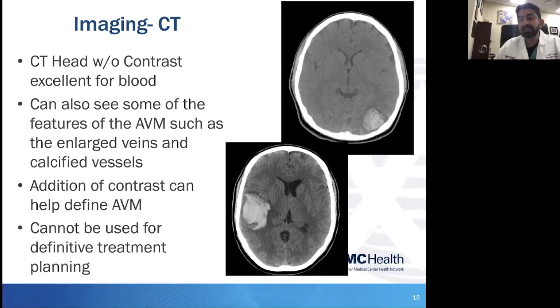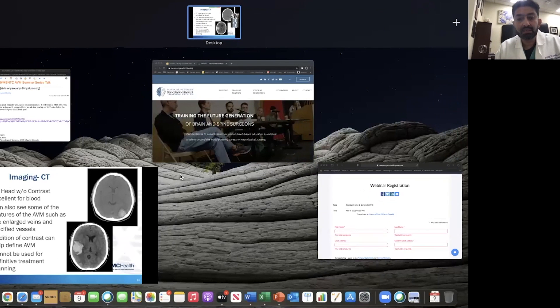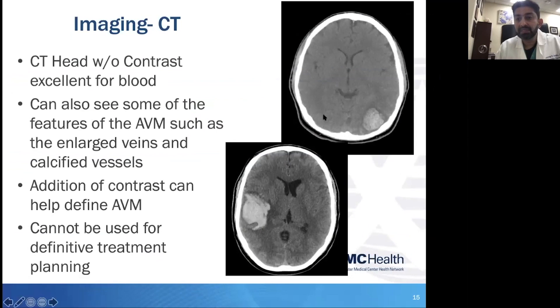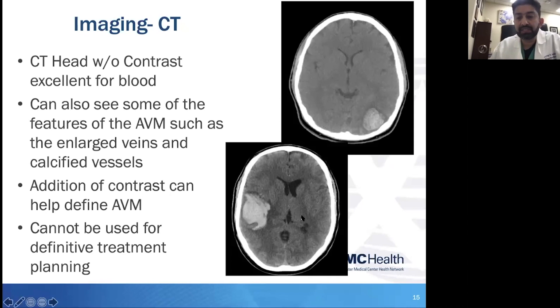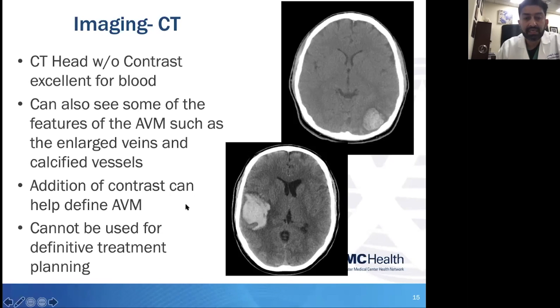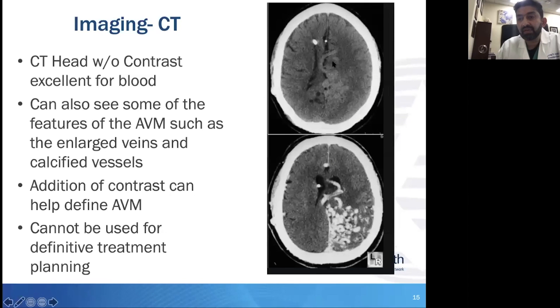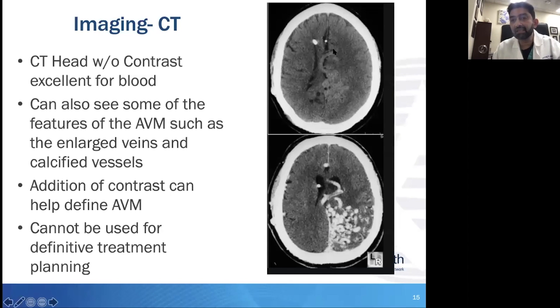On the CTs on the right, you can see some hyperdense lesions at both the upper and lower ones — obviously ruptures in totally different areas — but it at least helps quickly demarcate whether you're dealing with a ruptured or unruptured lesion. And then on some CTs, you can actually see features of the AVM. This is a nice example without contrast — you can see perhaps some assessment of a nidus and perhaps a draining vein, but you really need to add contrast to CTs to get some better delineation.